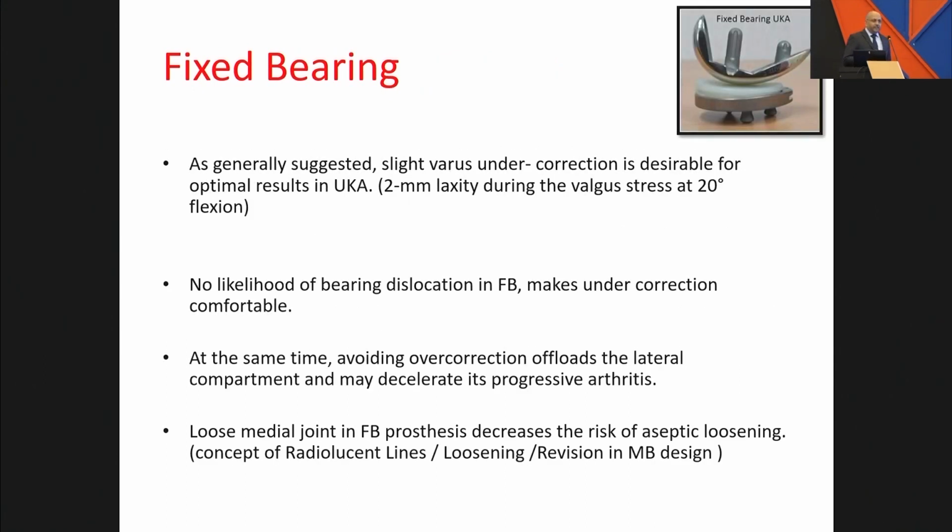But surgically, when you do all of it, what you know is that you are allowed to have a slightly loose medial compartment, and that makes your life easy. You can trial it, and if you are happy, you are happy. You are not overstressing the lateral compartment, and you are eliminating that factor of lateral compartment overload, and therefore reducing the chance of revision.